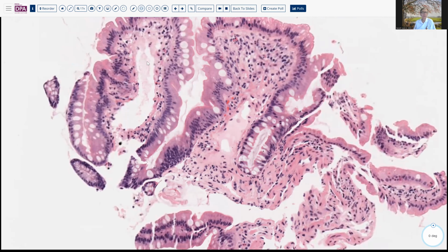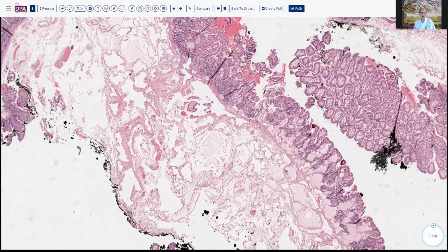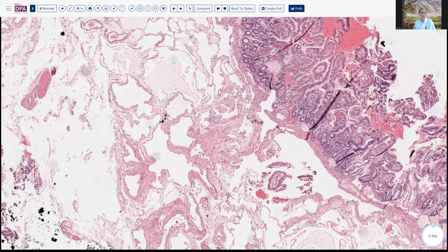So a resection was done, and you can see here that again we have quite a busy appearance in the submucosa, and quite dilated thin-walled tissue with really not much in the way of substantive tissue associated with it. A little bit of variability in the walls here, as you can see. Some are a little bit thicker than others.